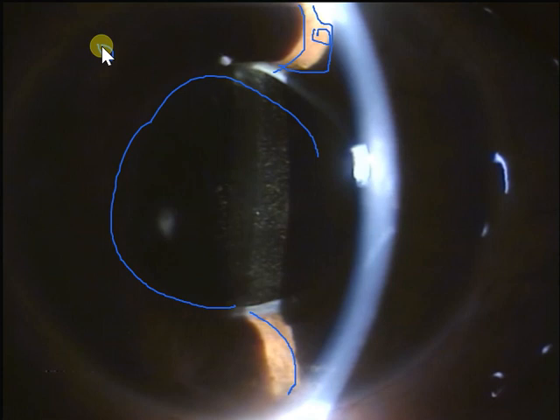This patient had intraocular pressure of 30 because of that, and that developed because he had uveitis. He has had initial vitrectomy, and then he had cataract surgery and silicone oil exchange before the emulsified oil. And here you can see in the periphery as well, there is shallowing of the anterior chamber.